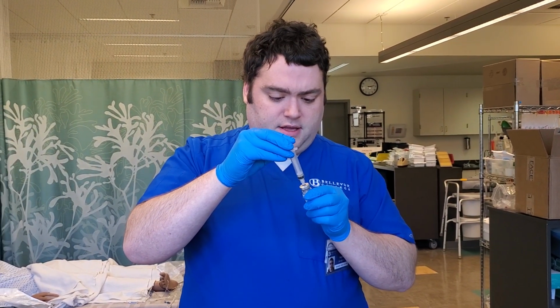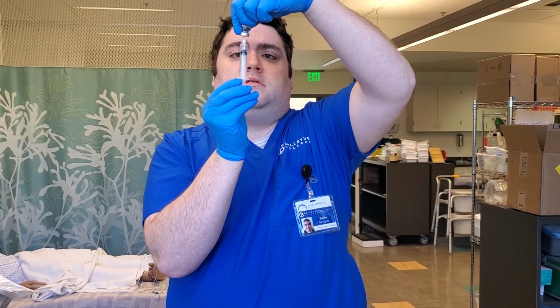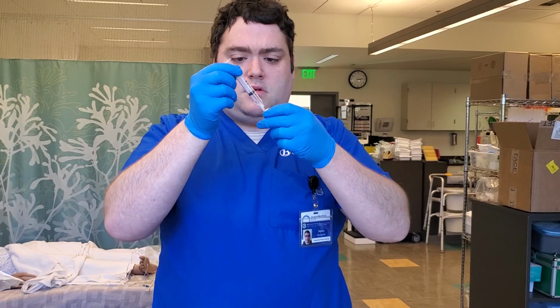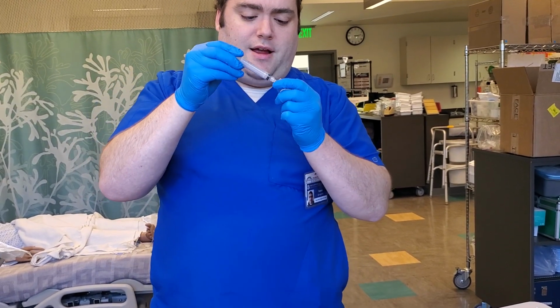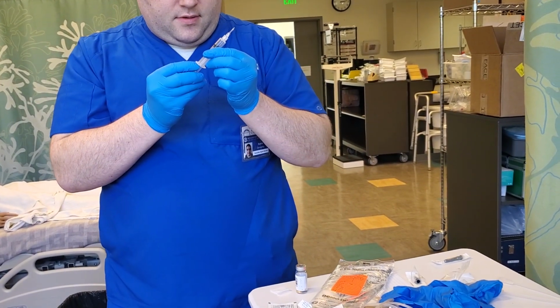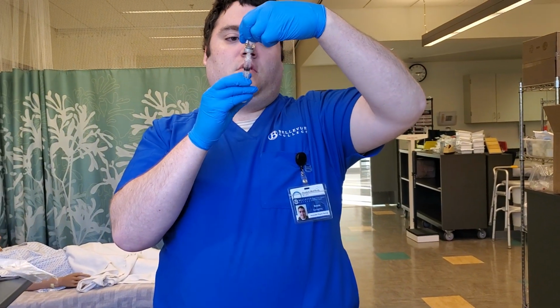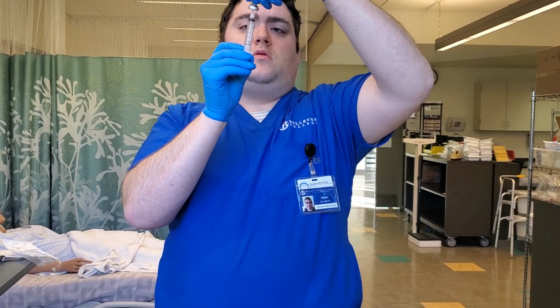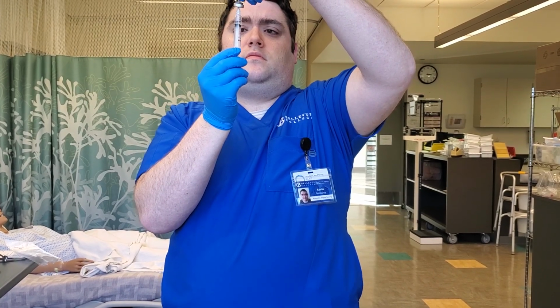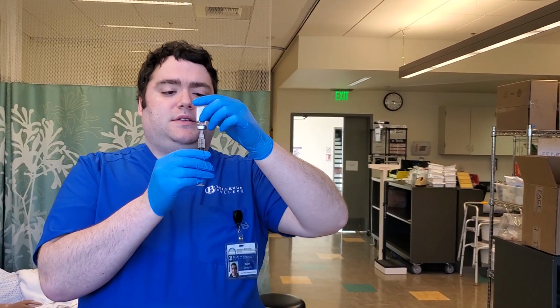Then we'll inject the air. Okay, let's try this again.